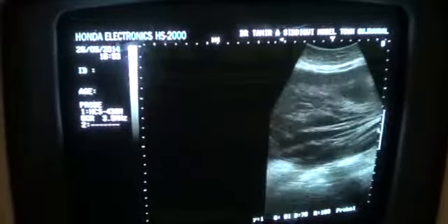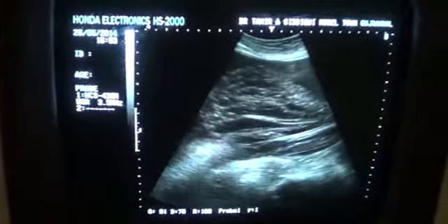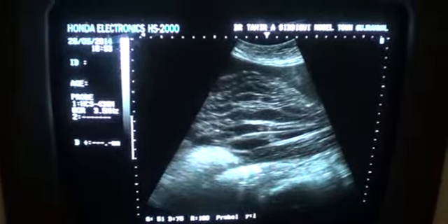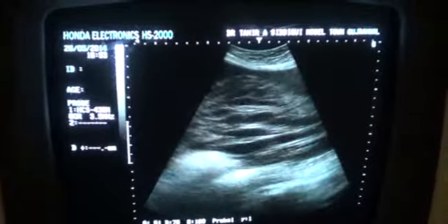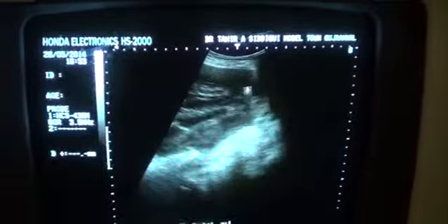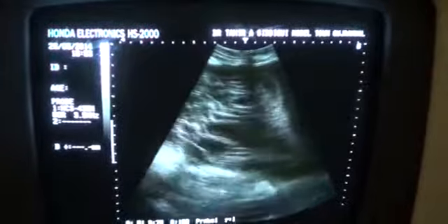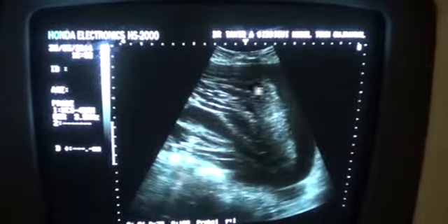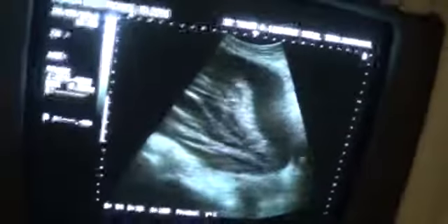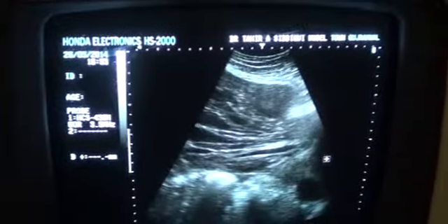And this fluid has linear, thread-like areas converging. They are all converging down into the pelvic region. Here this is the pelvis. So we see that all of them converge towards the pelvis. The rest is occupied by the fluid, and it actually starts from this region, from the pelvis.